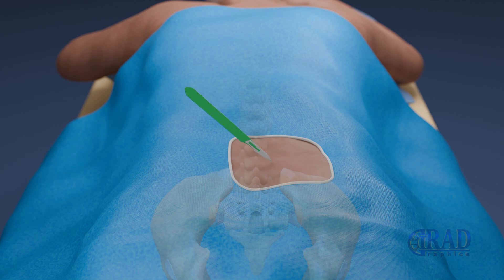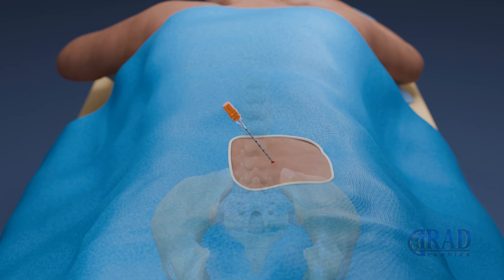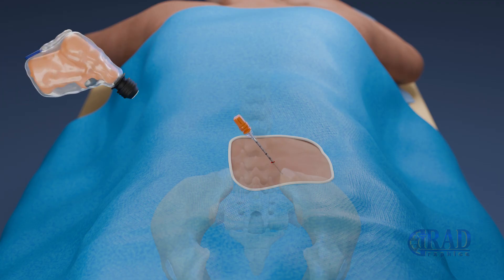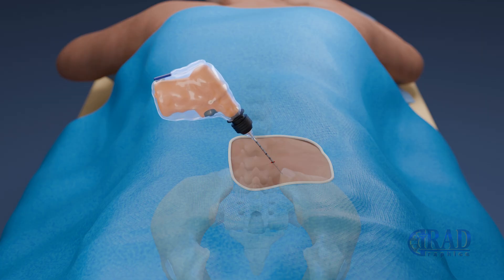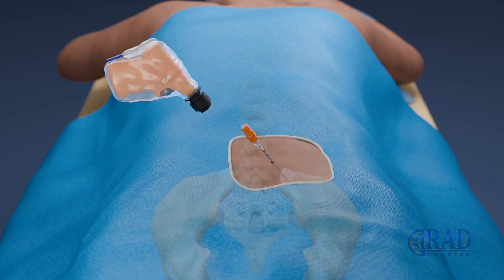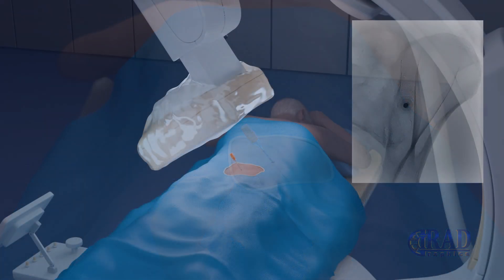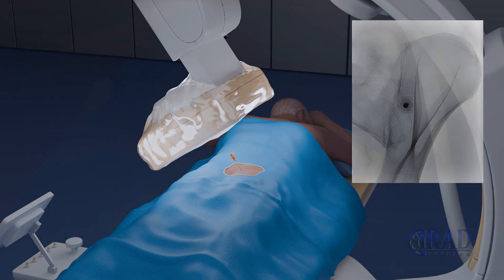After creating a skin nick, a bone biopsy needle is advanced through the skin and soft tissues under real-time fluoroscopic guidance toward the posterior iliac crest. As the needle reaches the bone cortex, it is advanced with gentle rotational movements until it enters the marrow cavity. The live fluoroscopy images help confirm correct positioning before aspiration.